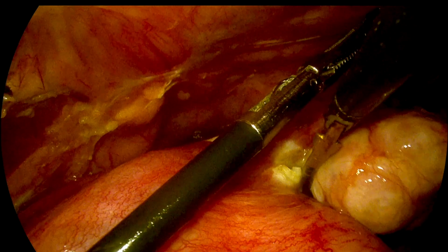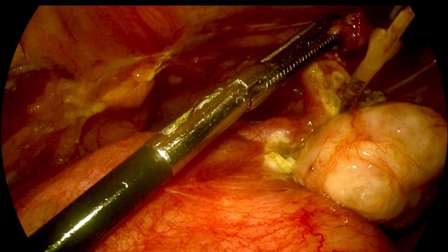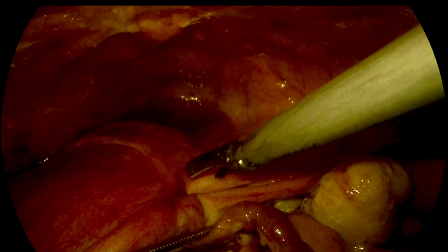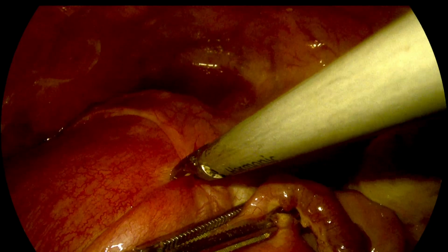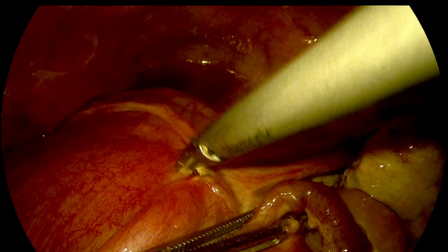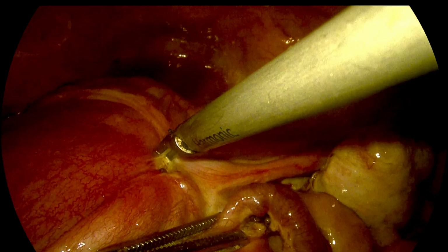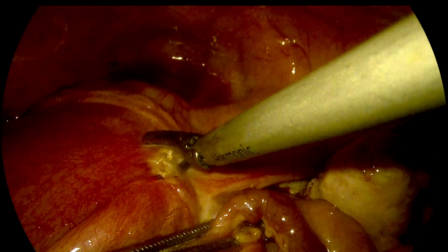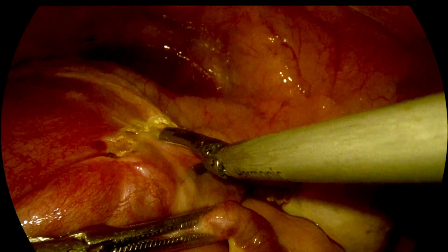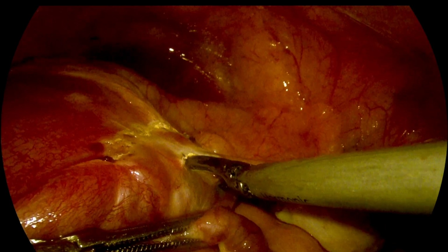Then we'll go ahead and divide the round ligament once these two pedicles are completely divided. So we can see, once the infundibulopelvic ligament and mesosalpinx are divided, the advancement of the bladder is doubled up. There is the superior surface of the bladder. It's not the base of the bladder that is onto the cervix. It is the superior surface of the bladder that is folded onto the anterior surface of the uterus due to the adhesions. It's not a normal location, and that is being separated and then divided.